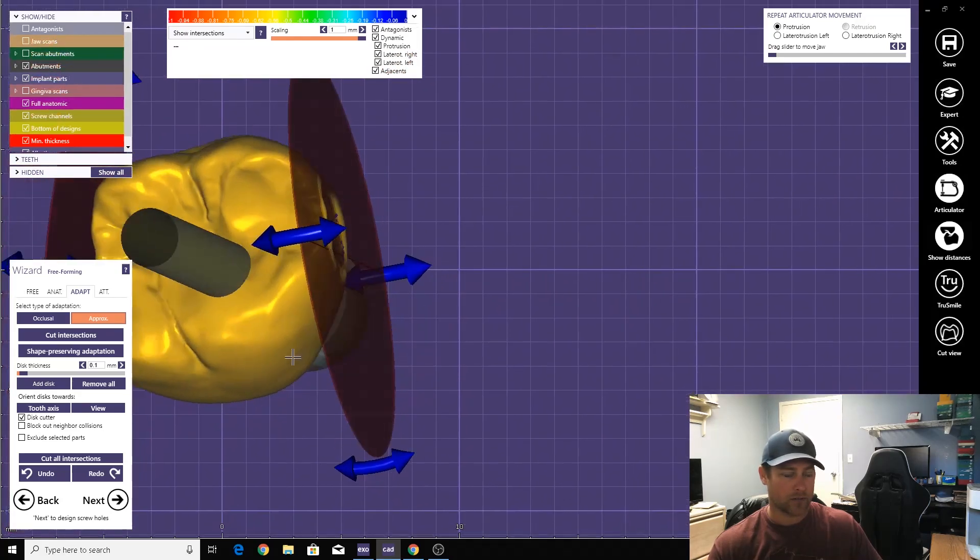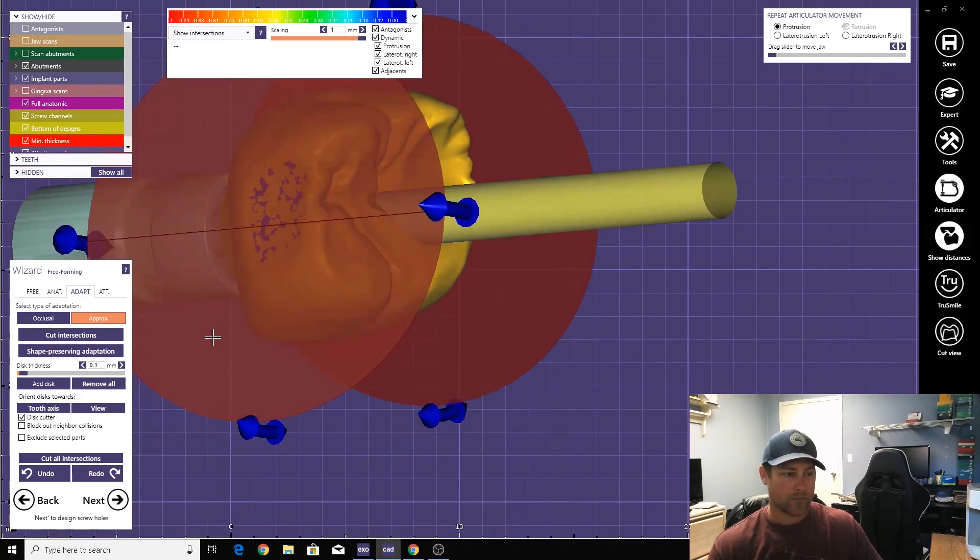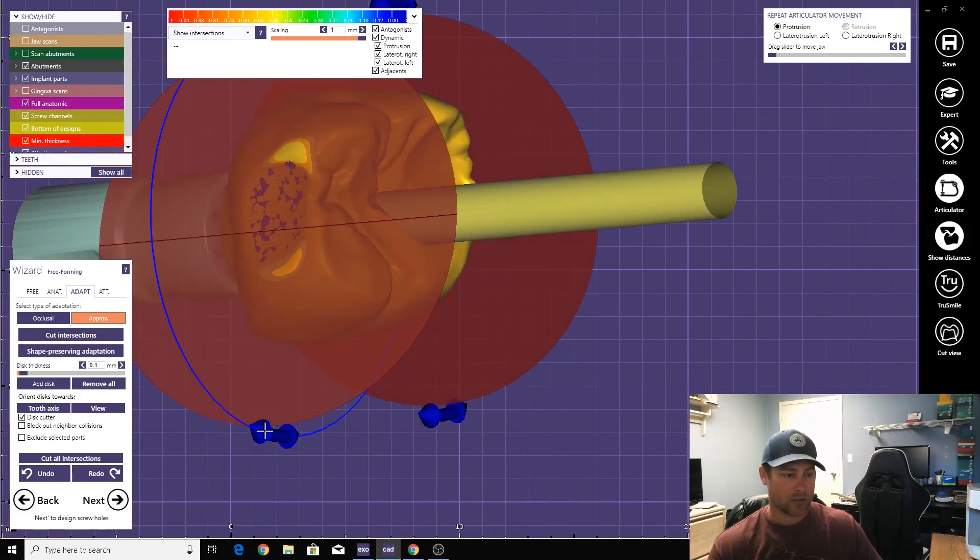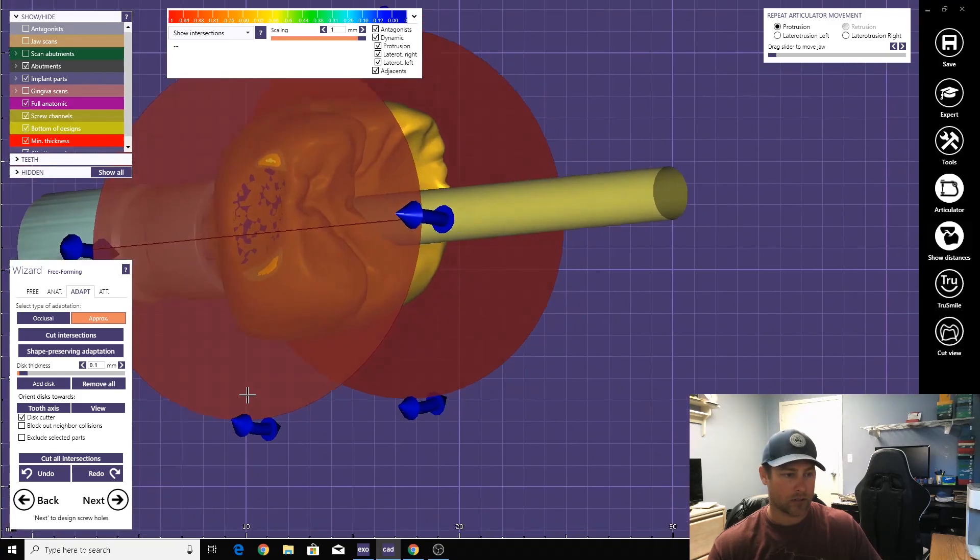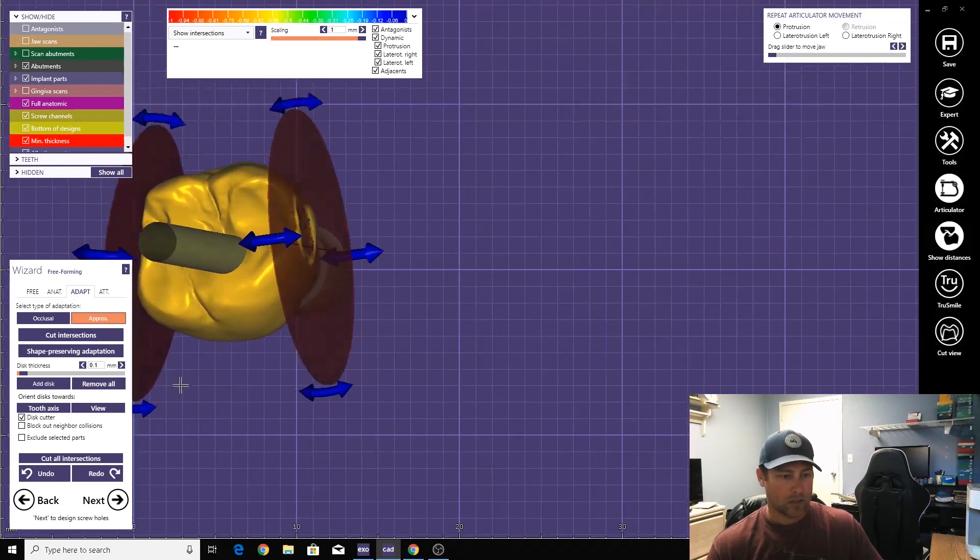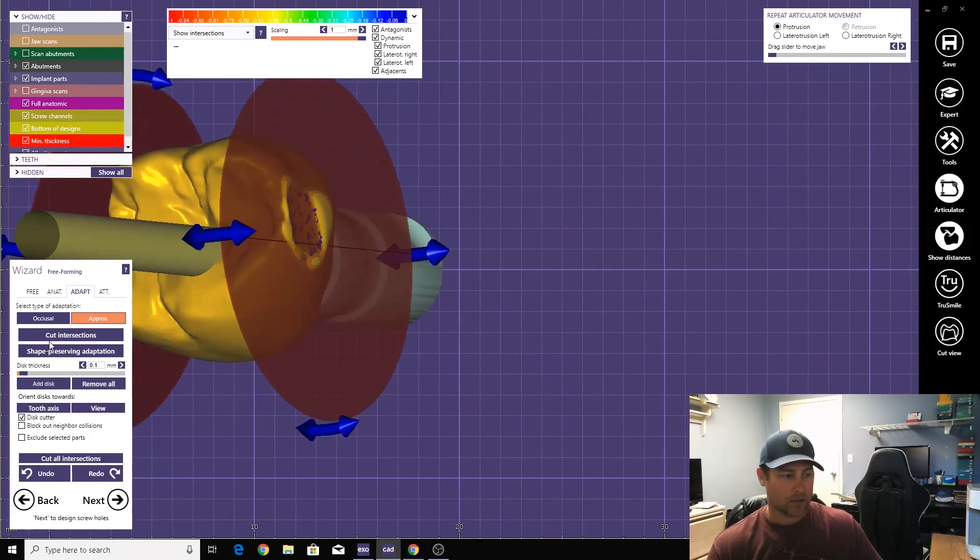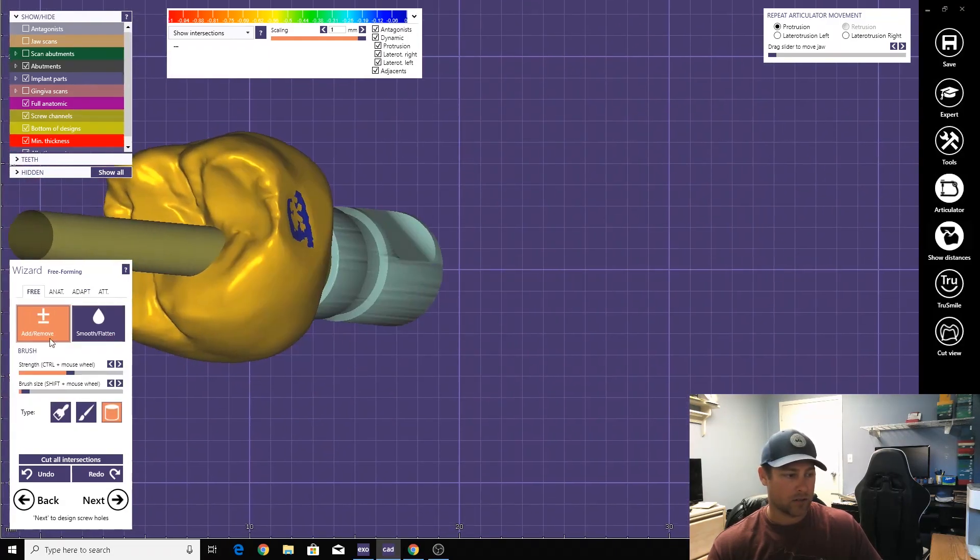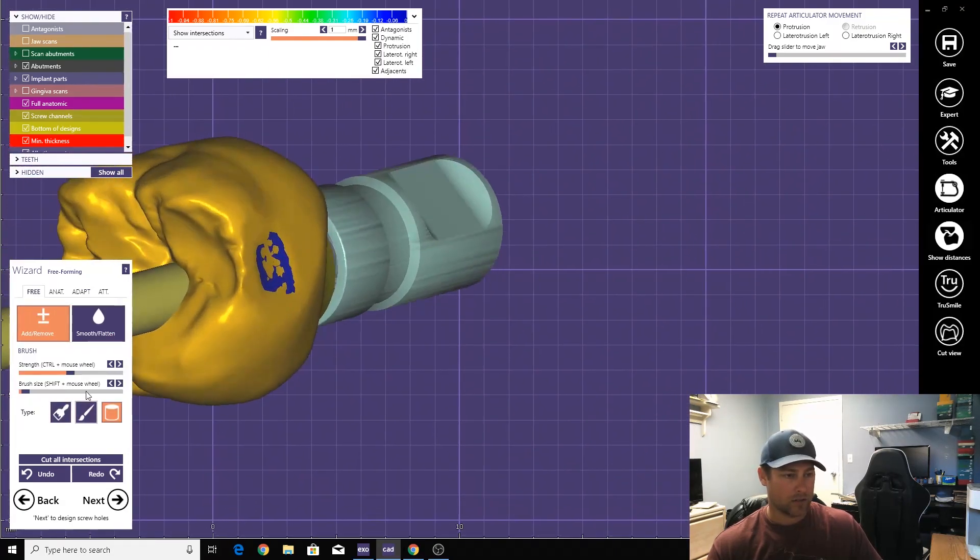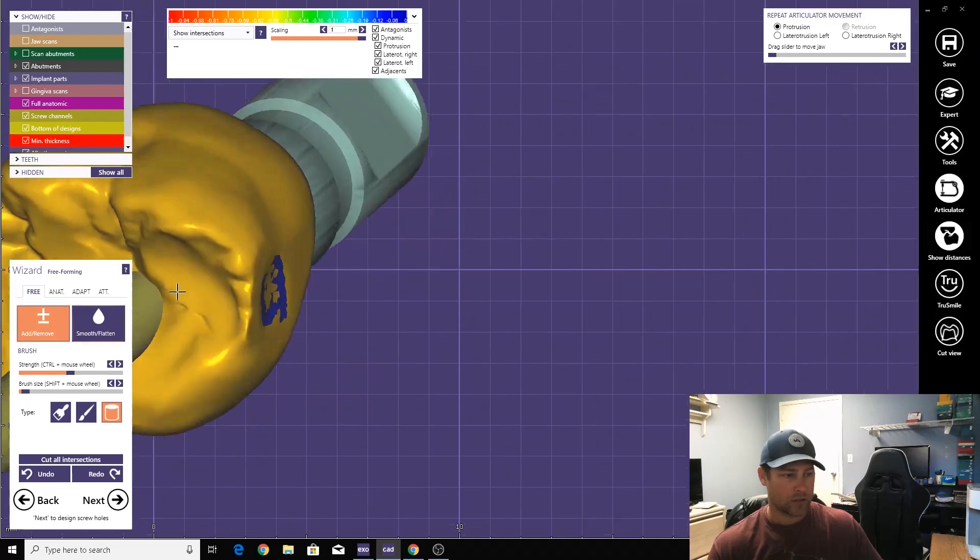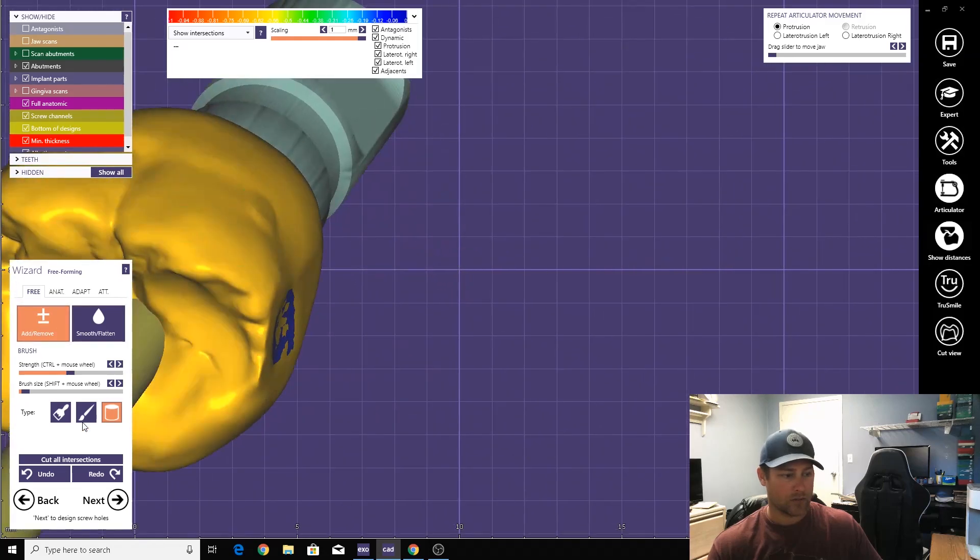So let's go ahead and knock out these undercuts. There's not a whole lot of undercut here. All right, that's all gone. Cut. Smooth it all out.